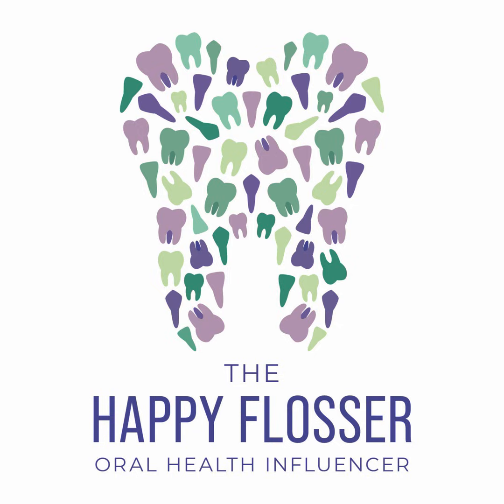One of the things that we have you look at when you're first learning radiographic interpretation is triangulation, which is really hard for students to depict on a radiograph because it's a very trained eye that can see very early stages of vertical bone loss on a radiograph. Now, good quality radiographs are the first step in providing the opportunity for you to evaluate and detect disease at its earliest state. There are some limitations to radiographs, but the first thing is to create a quality image so that you can detect this horizontal or vertical bone loss. So proper imaging is the first step.